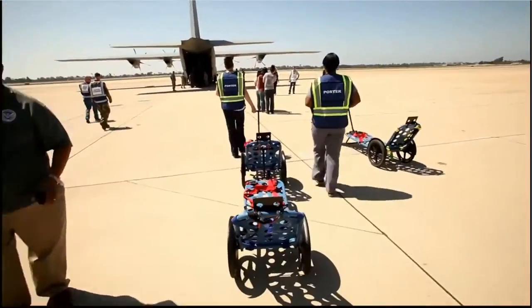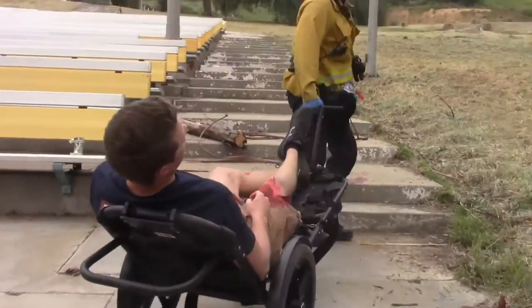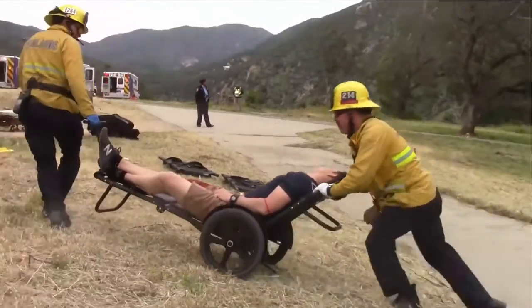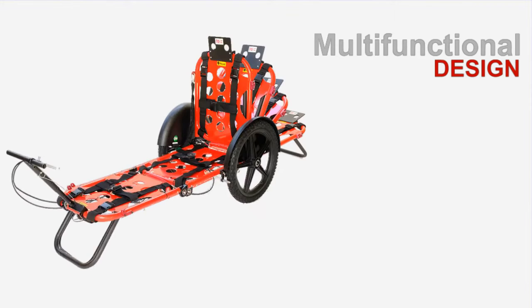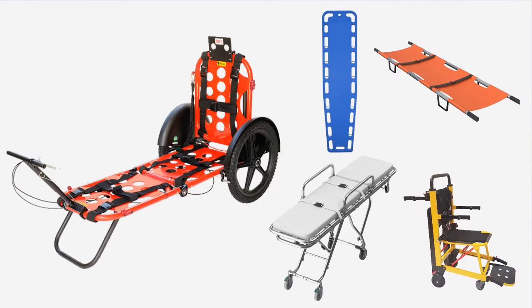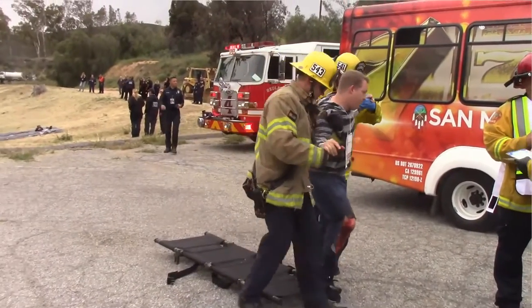The Rex is designed for rapid deployment by a single responder. The 360-degree maneuverability allows responders to safely move patients of any size through all types of terrains and conditions. Its multifunctional design provides responders with the flexibility of a backboard stretcher, stair descender, and gurney all in one system, minimizing the need to transfer patients from one transport system to another, saving valuable time and minimizing further potential injury to patient and responder.